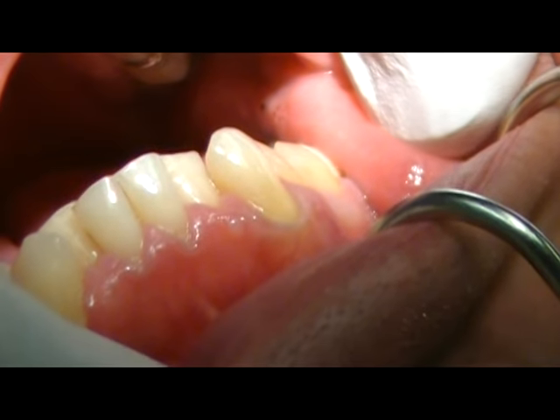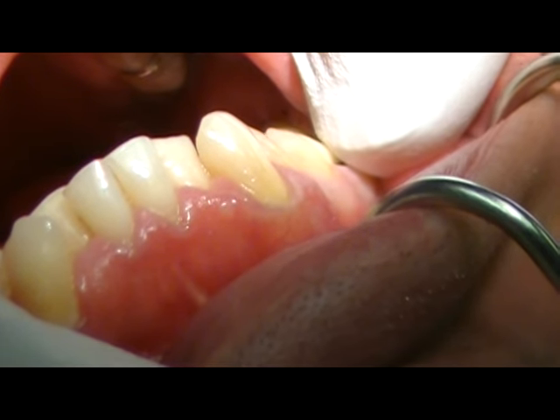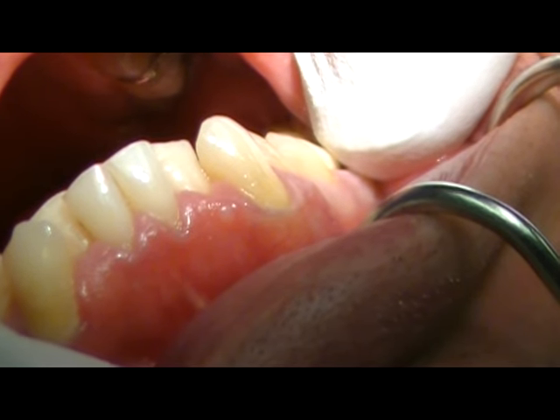Today we are going to take out the mandibular left second bicuspid for orthodontic reasons to create some space, using the mandibular universal physics forcep.